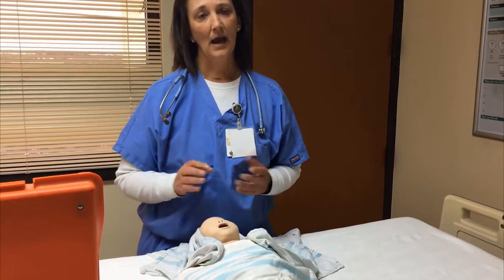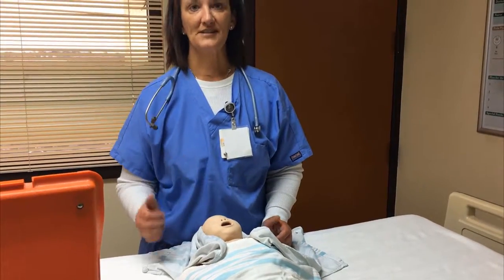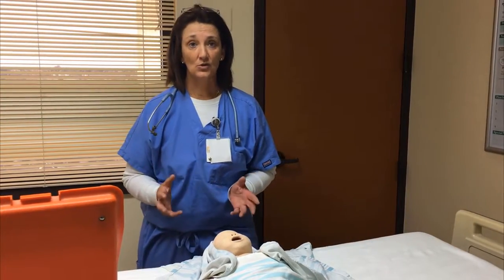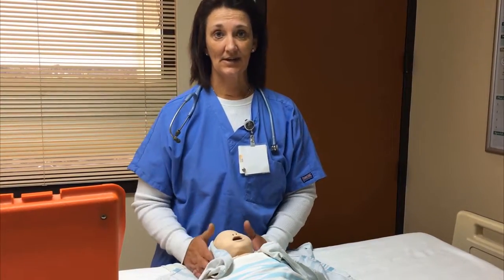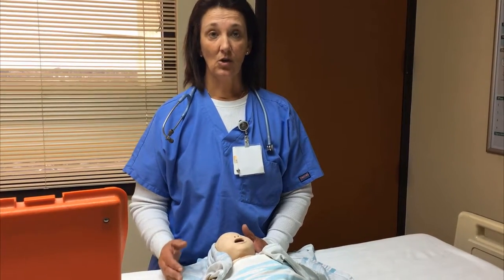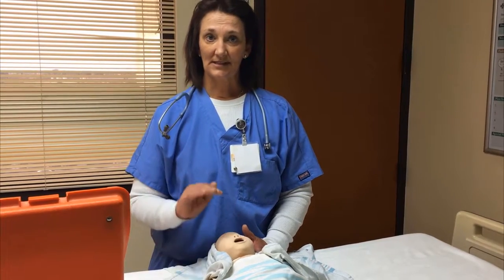But before that, I really want to go over what CPAP is and what the difference is between CPAP and positive pressure ventilation. CPAP is only used for a spontaneously breathing infant, whereas with positive pressure ventilation, you are rescue breathing for the baby. CPAP is a little bit different.